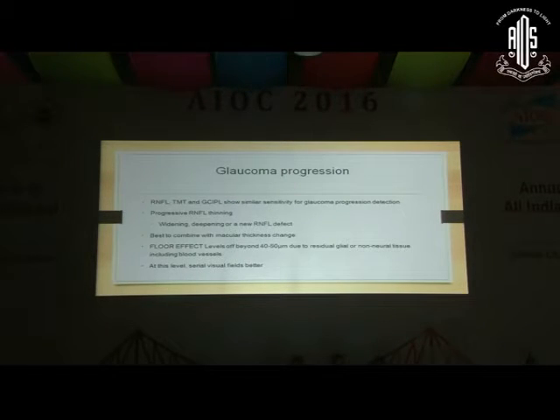These have the greatest significance. Now, how do we manage our glaucoma progression? If you look at all the parameters, the RNFL, the total macular thickness, as well as the GC-IPL, that is the ganglion cell inner plexiform layer, all three can be used. And progressive thinning will be seen as widening, deepening, or appearance of a new RNFL defect. But it is best to combine it with the macular thickness.